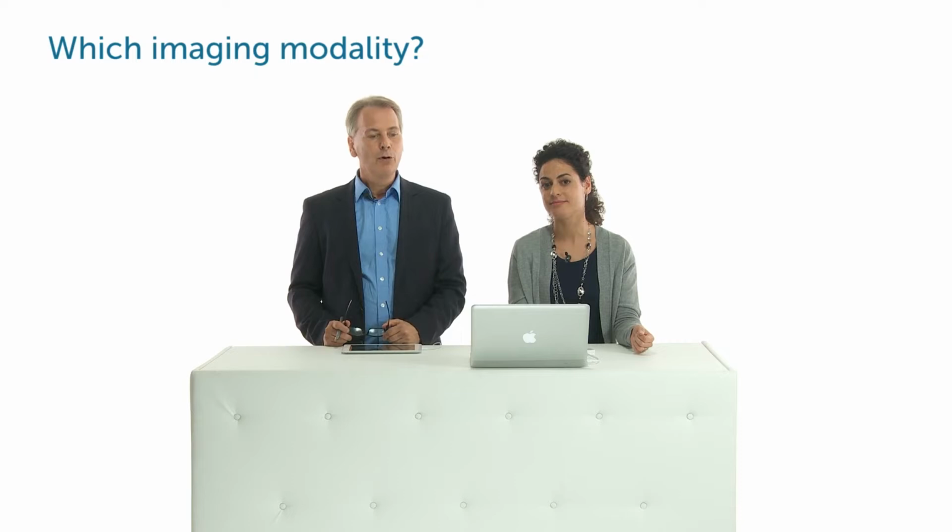So from what we've said here, you will understand that there's a very close link between dilatation of the aorta and dissection. But Thomas, at the beginning of this course, we showed a CT image together with a TEE image of the aorta. But which imaging modality would you use to assess the aorta? I think both, Anna. I think both have their role. First of all, it depends on how acute the situation is, and it depends on what you're more familiar with and what you have available. But definitely echocardiography has a role.